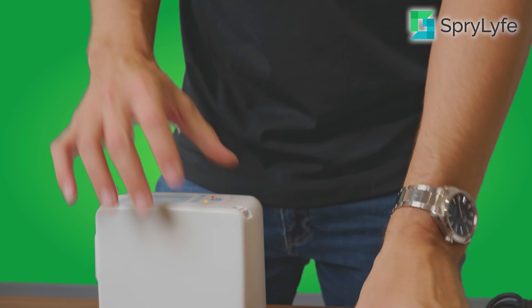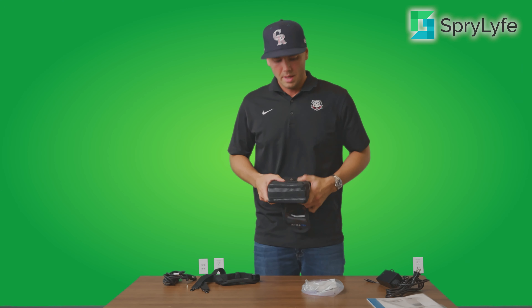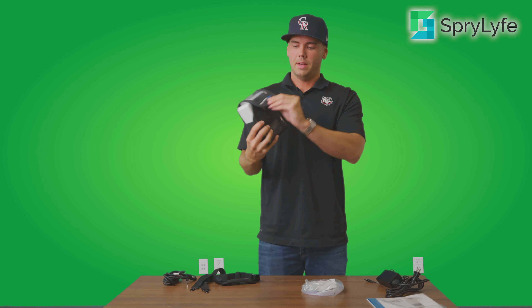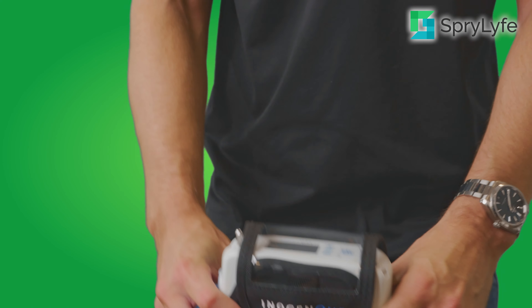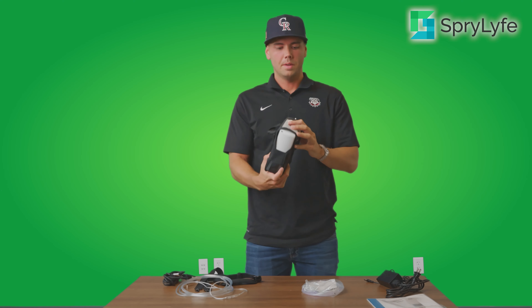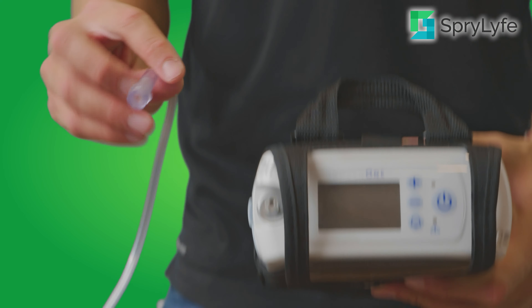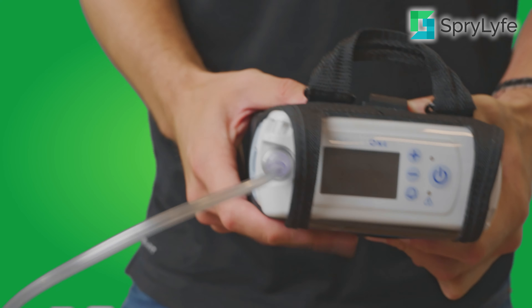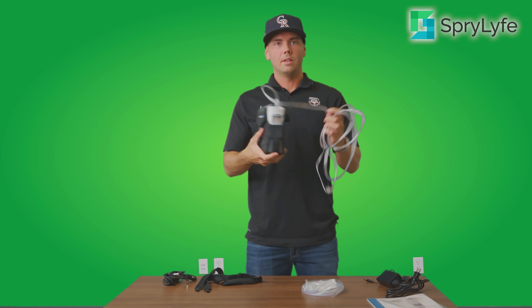Now we're going to put your Inogen 1 G4 with the battery connected into the included carry case. You want to make sure that you have the hole lined up so you can still access the charger while it's inside the case. It's got a button — button it down on the bottom if you're using the four-cell battery, or on the top if you're using the eight-cell battery. After you have it in the bag, you're going to put your nasal cannula onto the unit — just grab this end, slide it all the way down onto the Inogen 1 G4, put your cannula on, and you are ready to go.